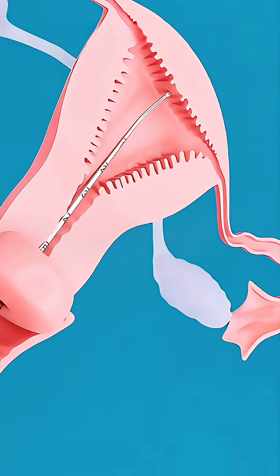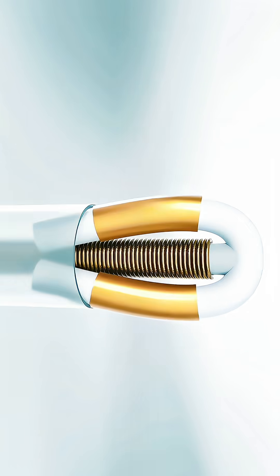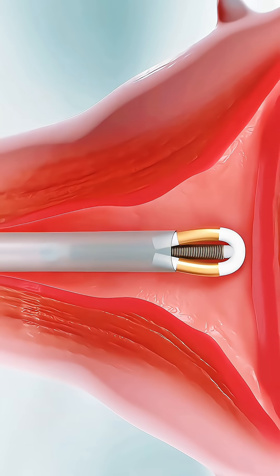Next, a small clamp holds the cervix steady and the depth is measured. The IUD is loaded into a tiny inserter, which is then slowly passed through the cervix and carefully placed into the uterus.